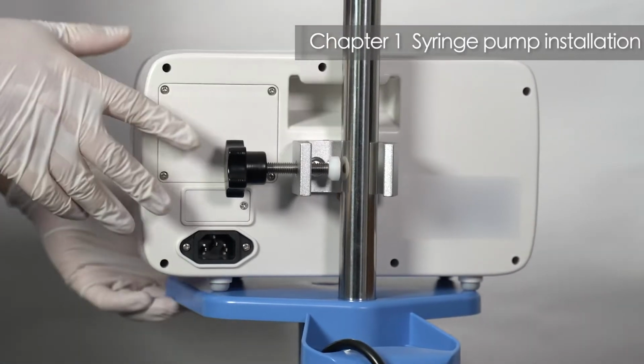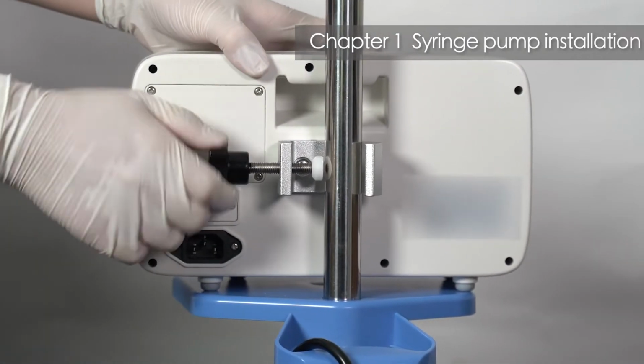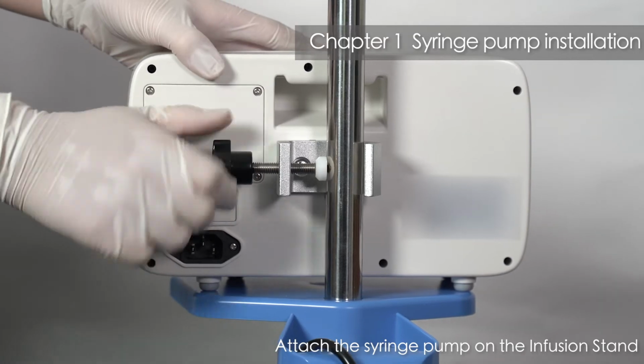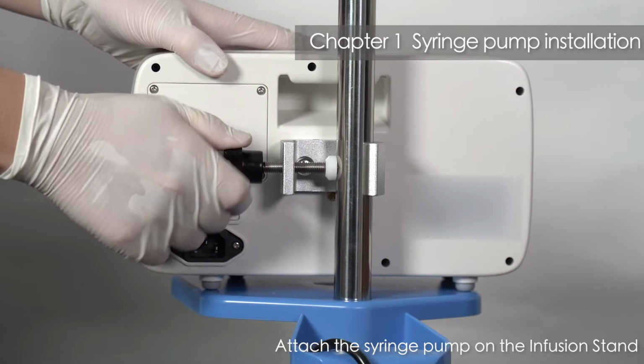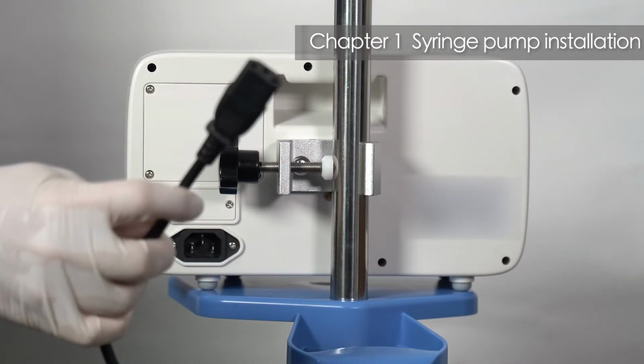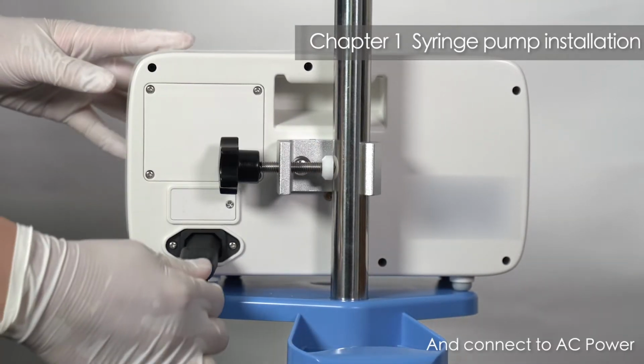Chapter 1. Syringe Pump Installation. Attach the syringe pump on the infusion stand, and connect to AC power.